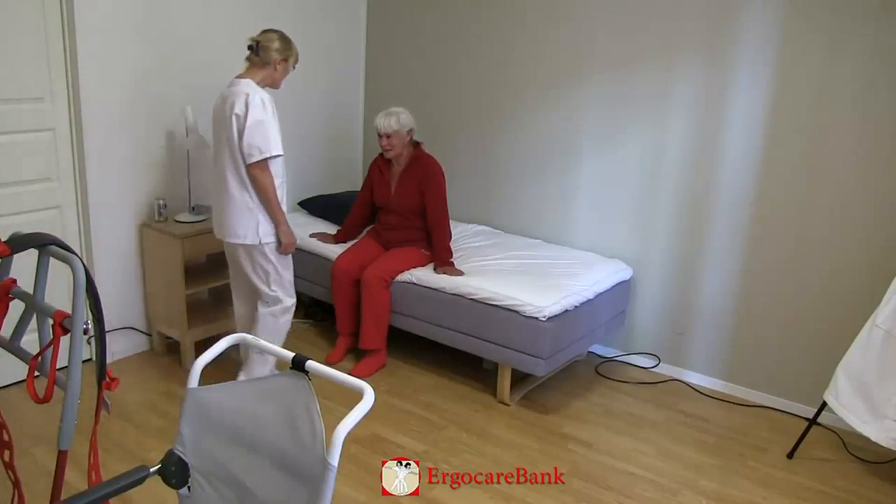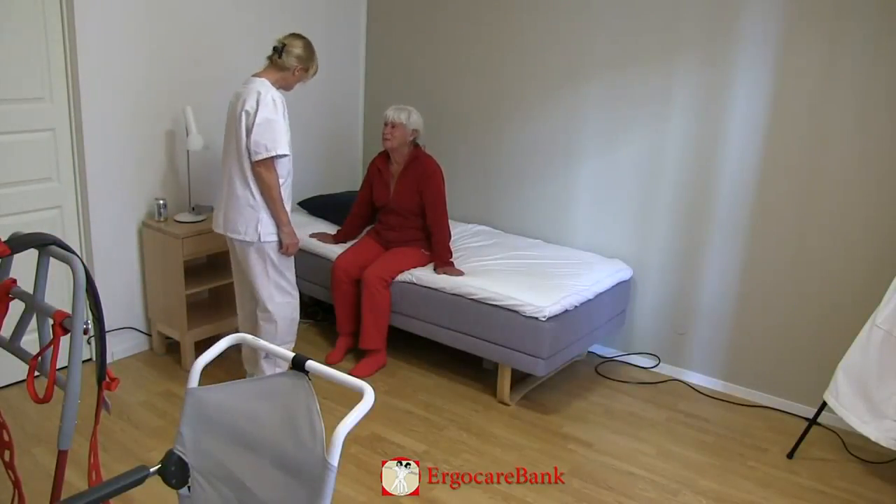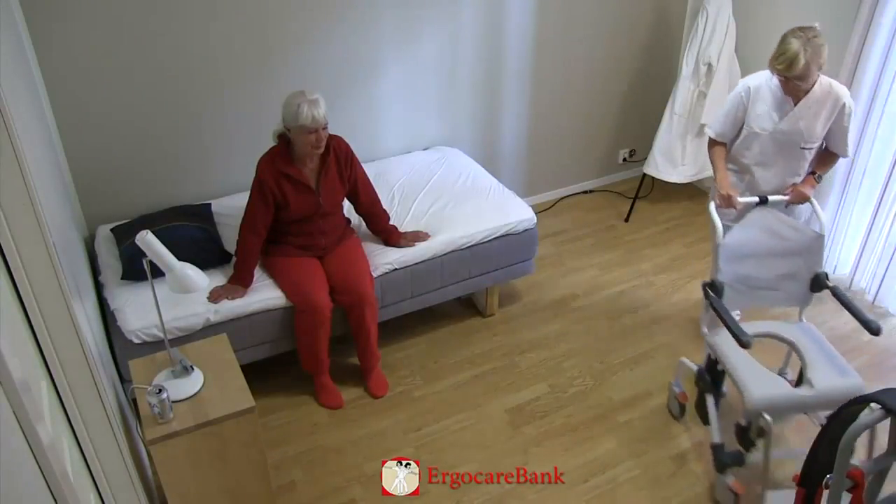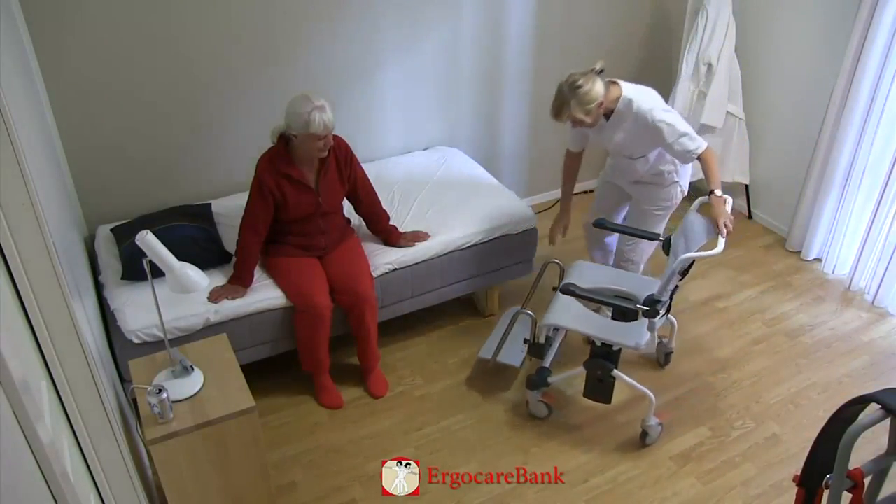Celia is going to the bathroom. The staff member is using a Raizer to help Celia to stand up and to transfer her to the shower chair.